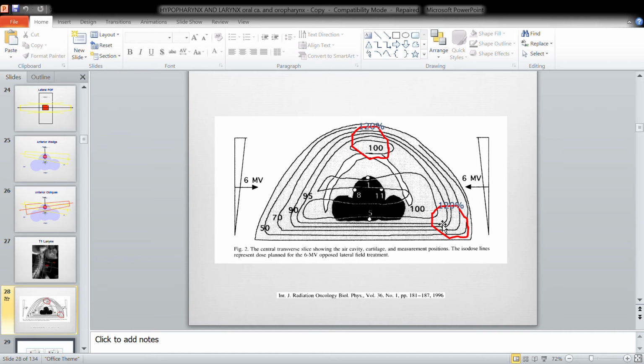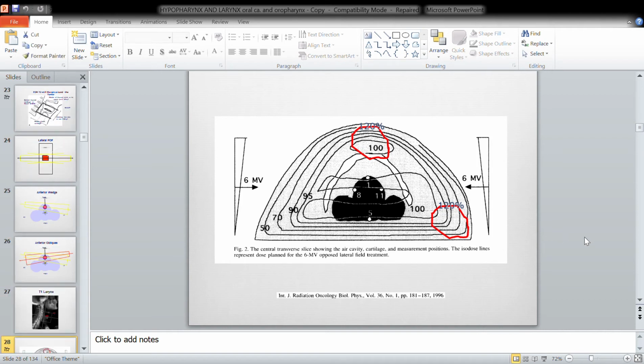so how would you improve it? And then the quick answer, because you are very stressed in the exam, you would say, oh, if I want to reduce the dose here, let's make this angle thicker. I know this is what usually happens. And you say, I will increase the wedge angle. So instead of a 30-degree wedge angle, I will use a 45-degree wedge angle.